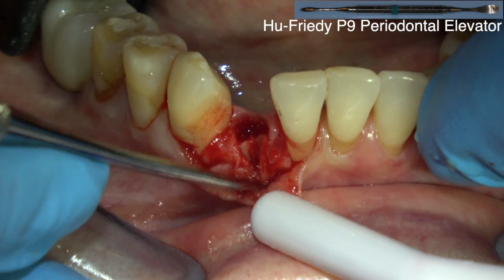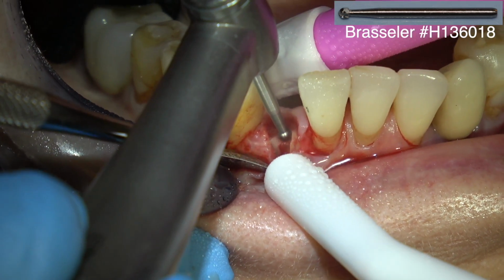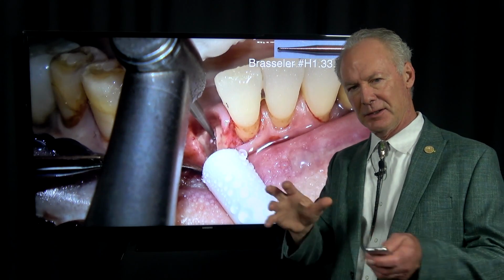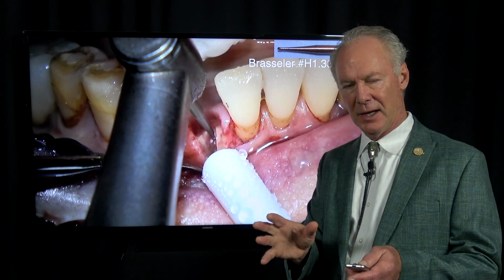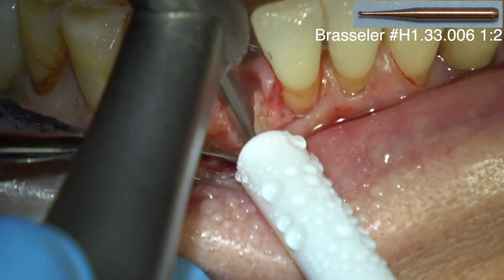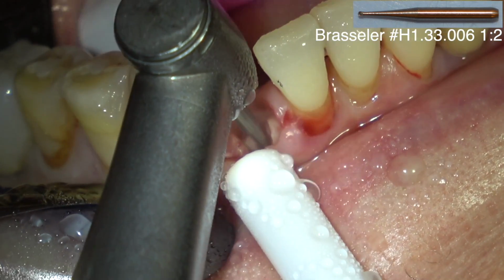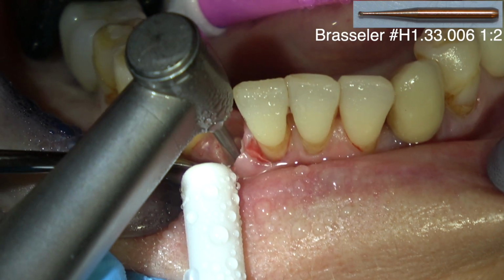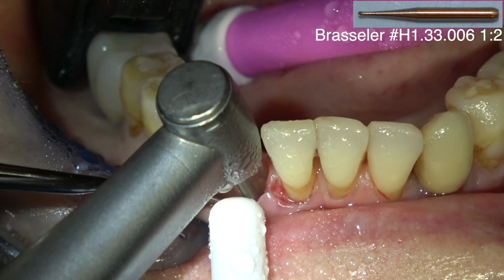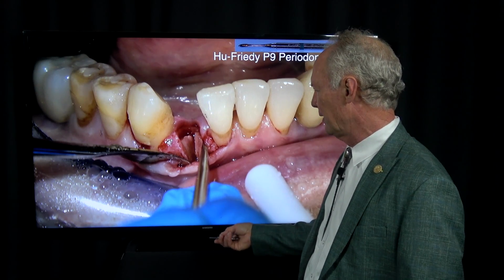Now this is a very small, long shank round burr, trying to dissect the root into two parts. Now remember, I elevated it to begin with. So my hope is, it looked like the entire tooth was moving in the socket, which makes extraction of the roots easier. So I'm hoping that's what happened, and I've just got to create some space. I'm going to try to divide the root into two parts and elevate them into the space I'm creating. It's just the smallest long shank round burr. So the good news is, in the mandibular anterior region, I'm not worried about drilling into the inferior alveolar nerve.